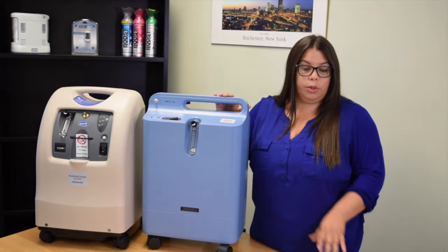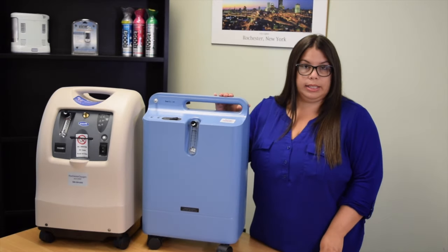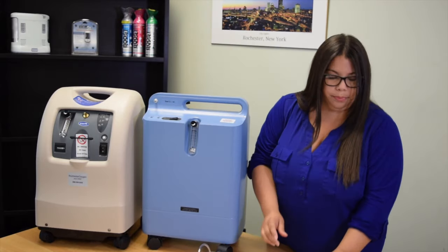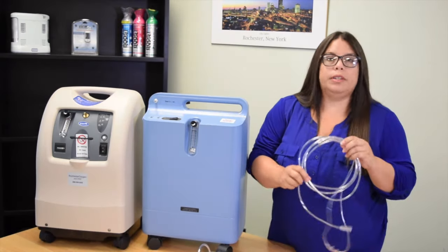Along with your concentrator you will be receiving a bag of supplies. In that bag you will find the 50-foot tubing, the swivel connector, and the 7-foot cannula.